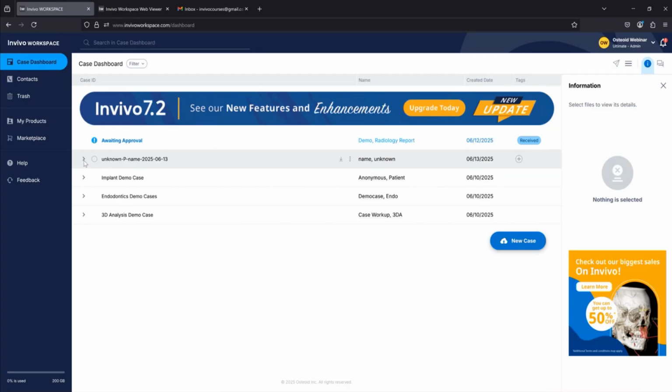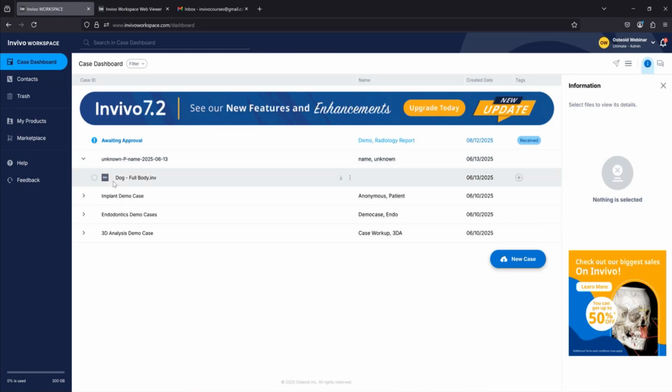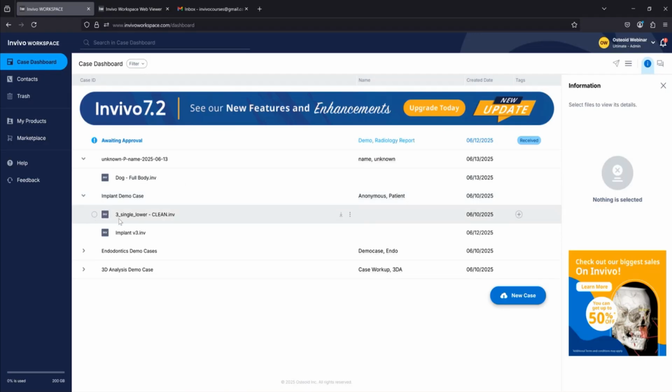So these patient folders can contain anything from the scans themselves, which this one in particular just has the scan, to things like multiple scans, maybe a pre-op and a post-op, or even PDF images if we've exported images out or we've created a report, which I believe this one might encompass some of those details. It can also include things like an STL file format or data set that pertains to that patient as well.